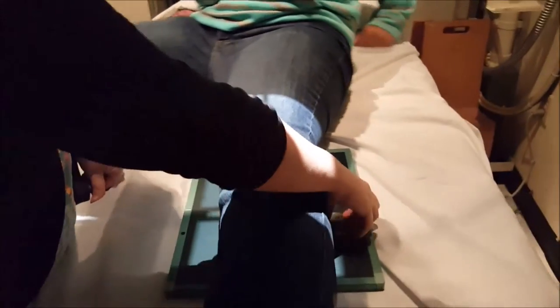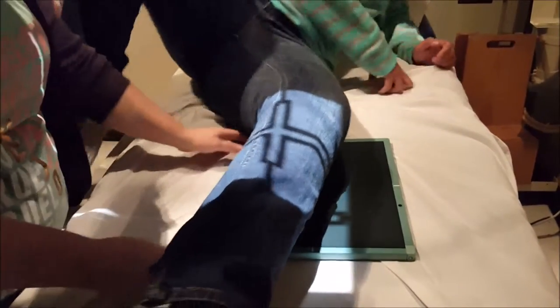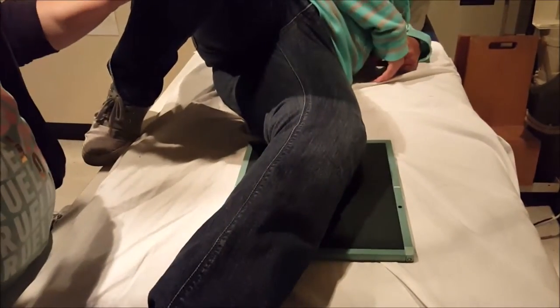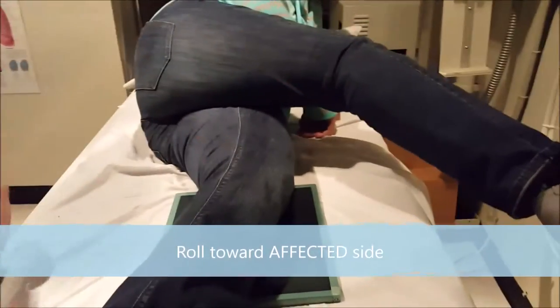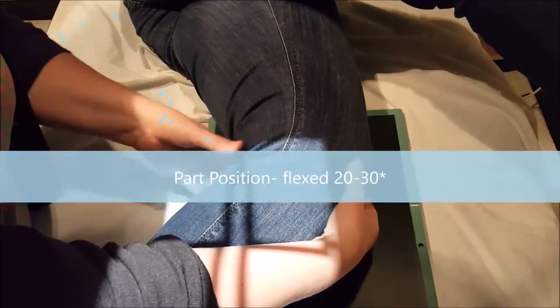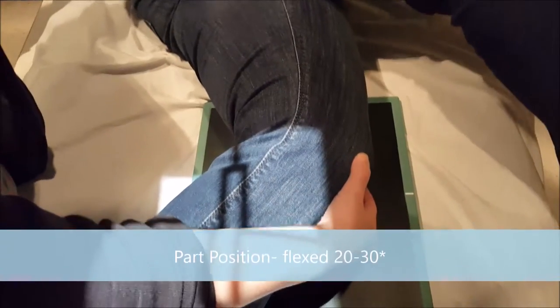For the lateral knee, you're going to have the patient roll all the way onto the affected side. So since we're doing her left knee, she's going to roll all the way onto her left side. And have the patient bring their unaffected leg across. You're going to flex the knee 20 to 30 degrees. Let me just make a sponge here. Now I like to feel for the patella to make sure that the patella is nice and lateral. I'm going to have you roll forward just a smidge. There we go.